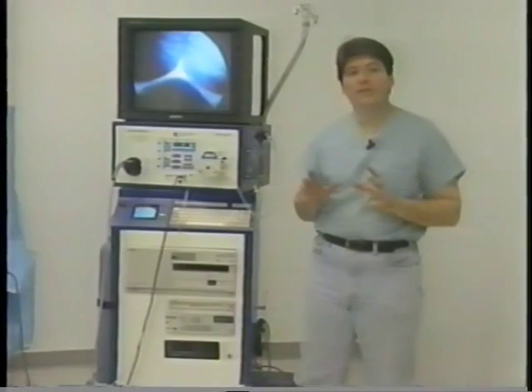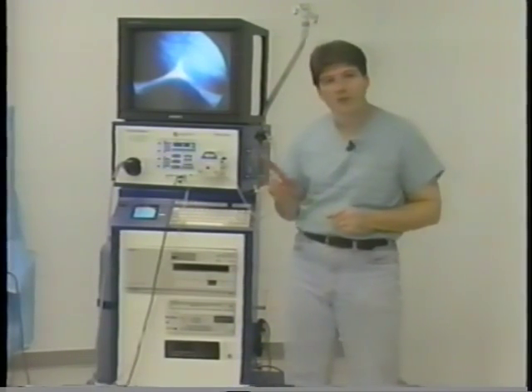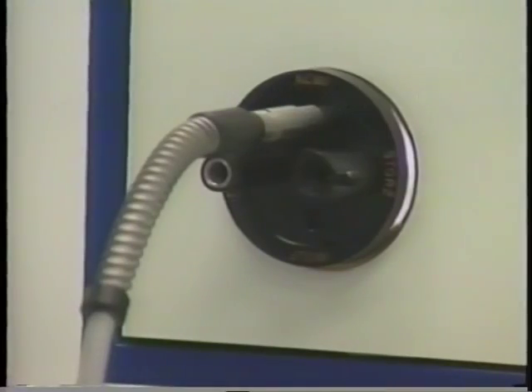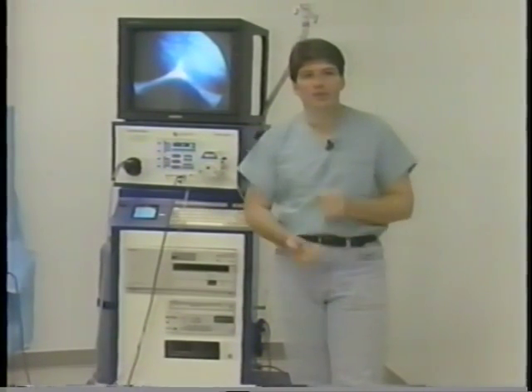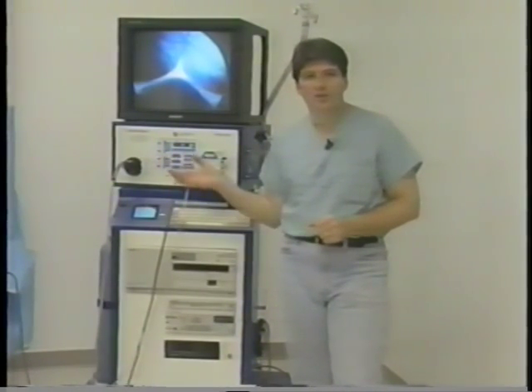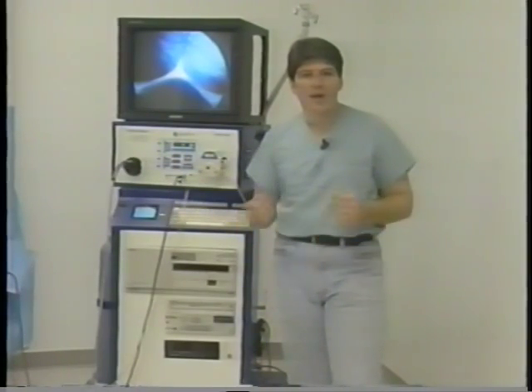Now I'd like to go over all of the individual devices that make up the Vision 2020 system, starting with the 300-watt Xenon light source. Our light source is designed with connectors built into the system so that you can hook up anybody's light cable without any special adapters or connectors. This is important because nurses will very often lose those, and then your whole system is down just because you're missing a little connector. Our Xenon light source is designed so that you can simply rotate this device and plug in anybody's cables.